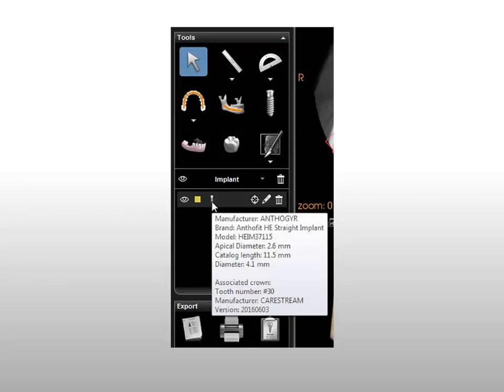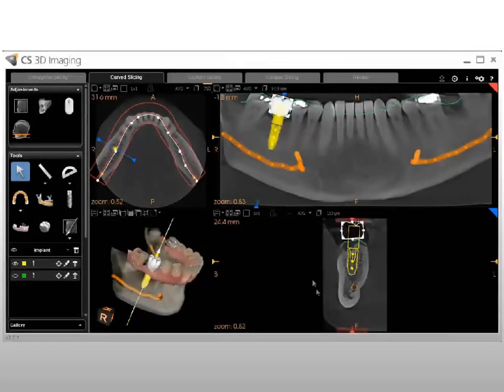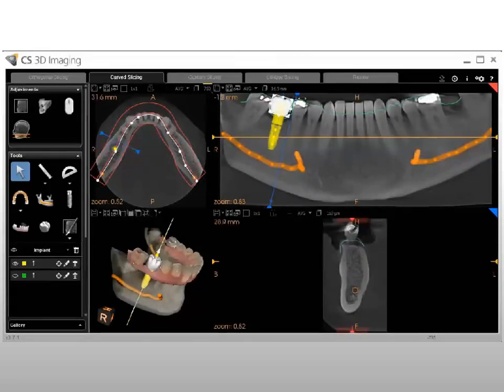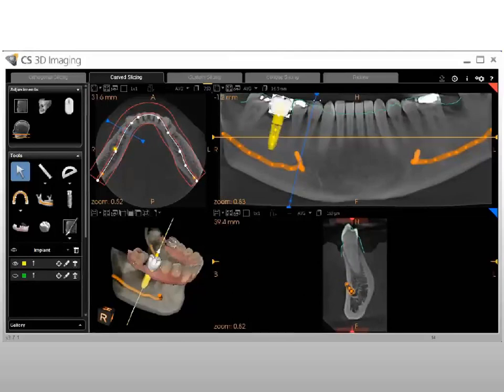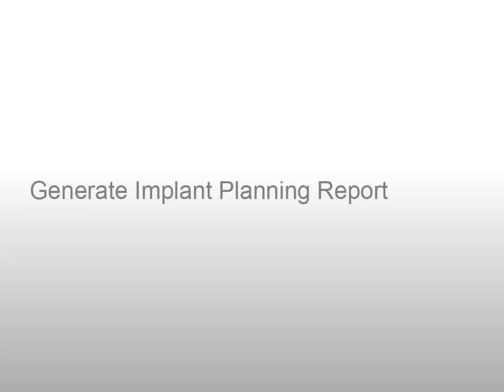To display implant information, in the Implant section of the Object Management panel, hover the mouse over the Small Implant icon — a tooltip is displayed containing implant information. If you move the view in the volume and the implant disappears, click the Bullseye button in the toolbox to automatically center all views on the implant. When the implant placement is complete, you can generate an Implant Planning Report.